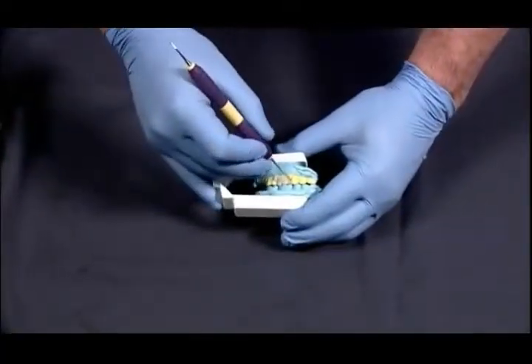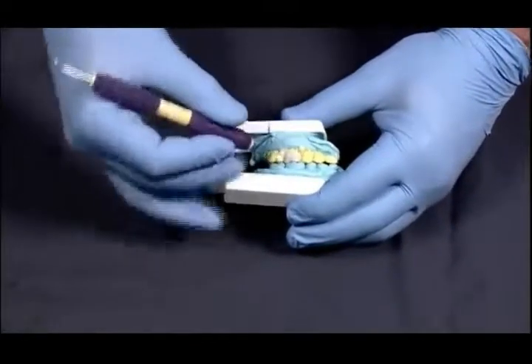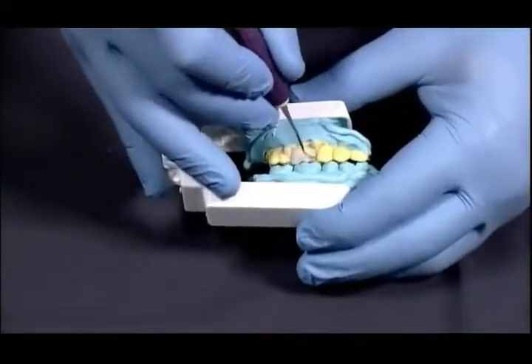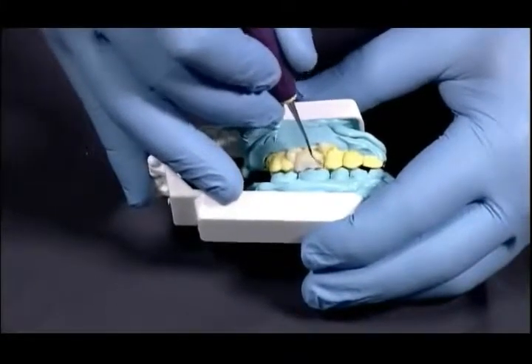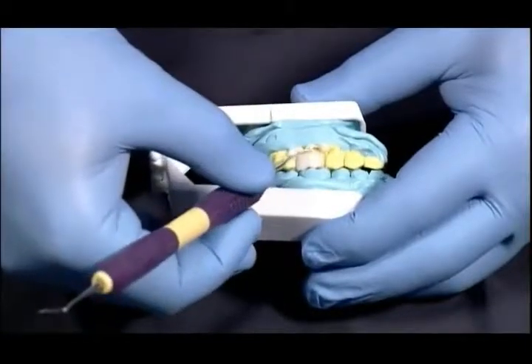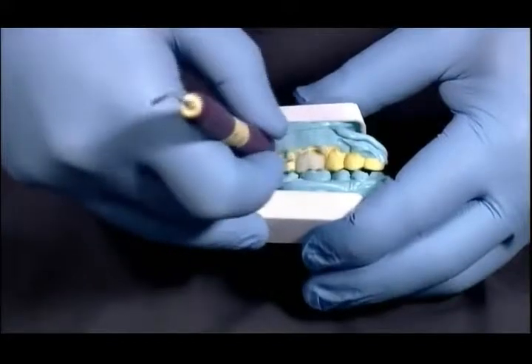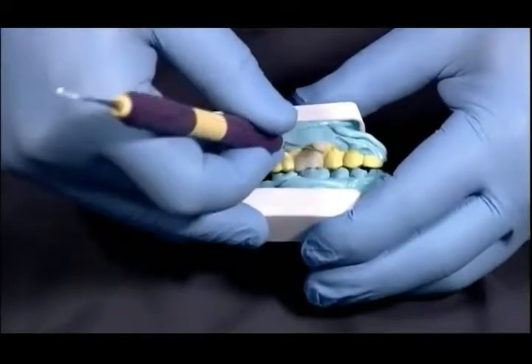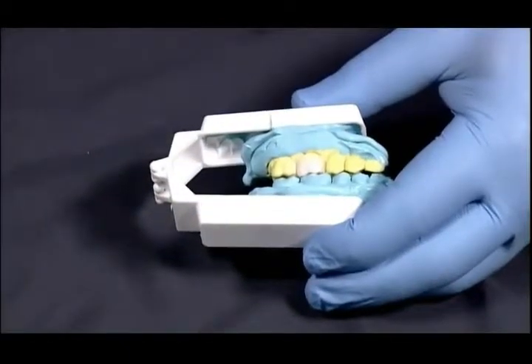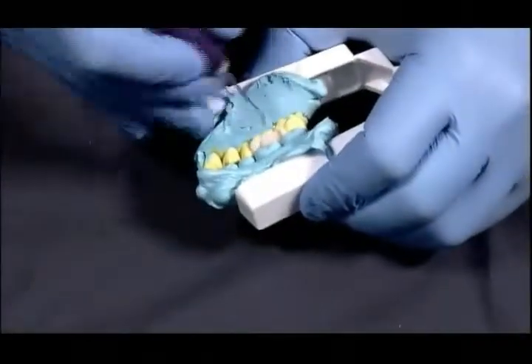Now that we have it fully articulated, you will start to remove the excess resin material. Now this crown shell, the Direct Crown Natural1, is made out of a translucent material that you can actually change the color of the tooth in the process of restoring. So what we'll do is remove the excess, and once we get it fairly well adapted to the tooth, the next step that we will do is cure it.